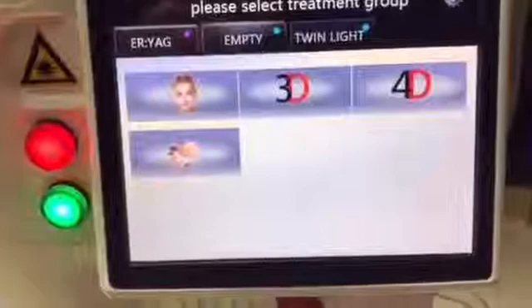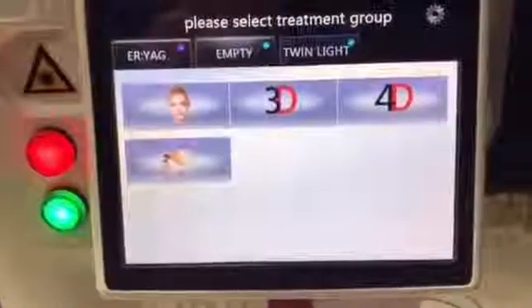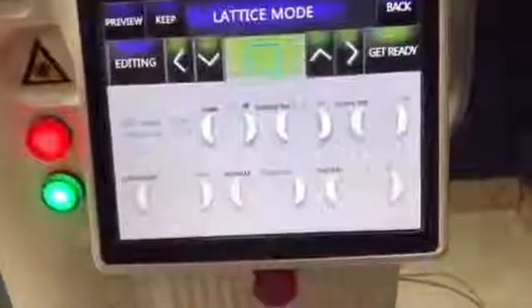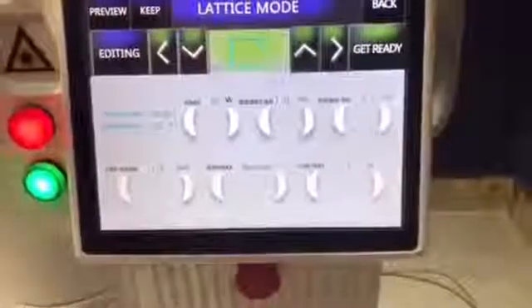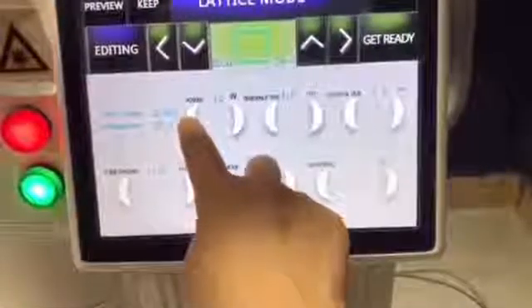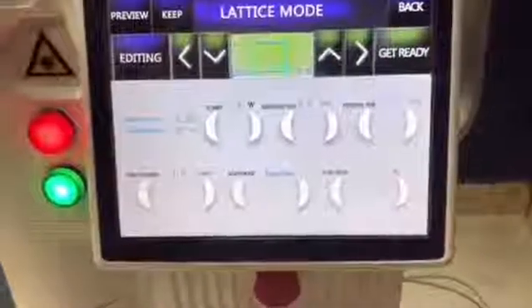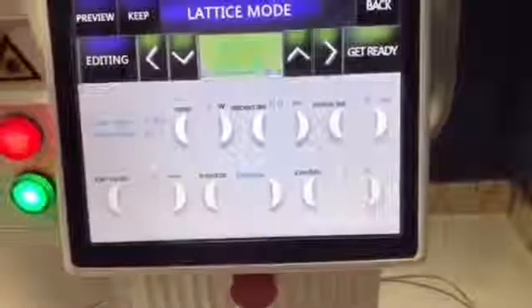Fractional mode is used for skin rejuvenation, acne treatment, stretch mark, and scar removal. Power is adjustable from 1 to 60. For skin rejuvenation, we usually set the power from 5 to 10. For acne or stretch mark removal, we set from 8 to 20.